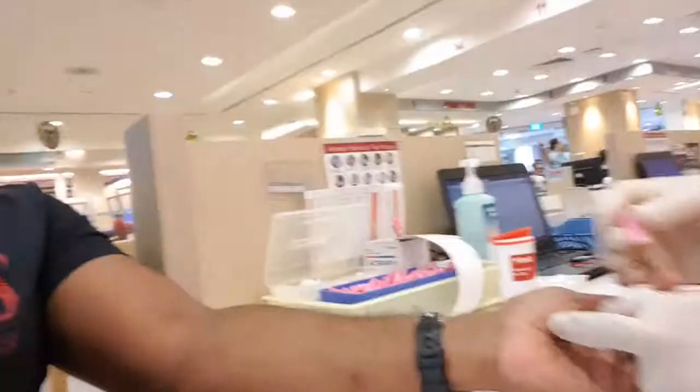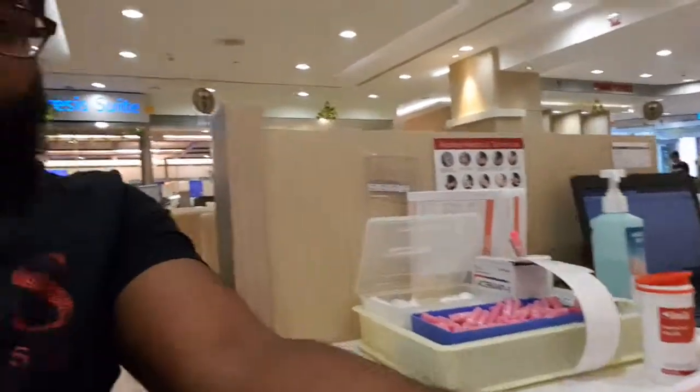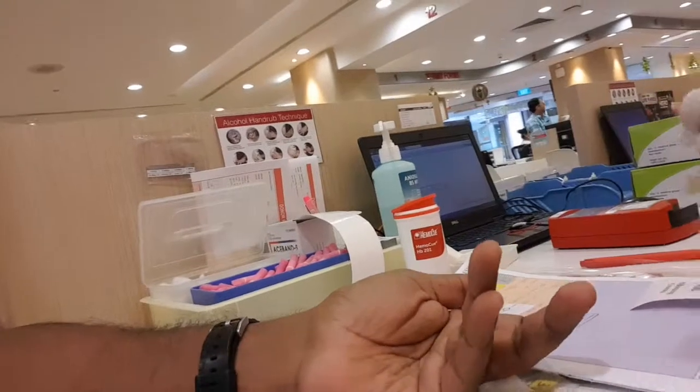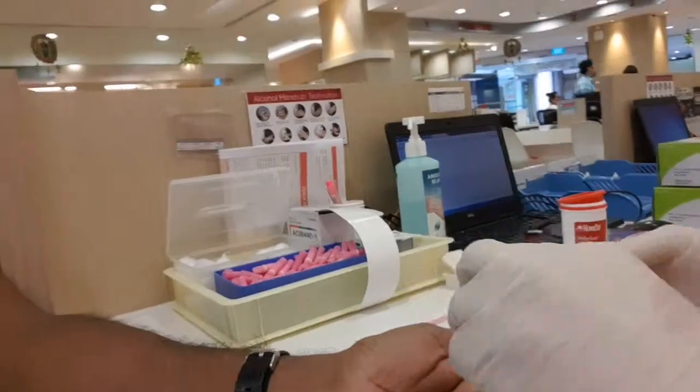This is the iron check level, so we need to take a blood sample — you can see here. It's not painful at all, just like an ant bite — I think not even an ant bite. It's very, very light. This test will take about a minimum of three minutes.